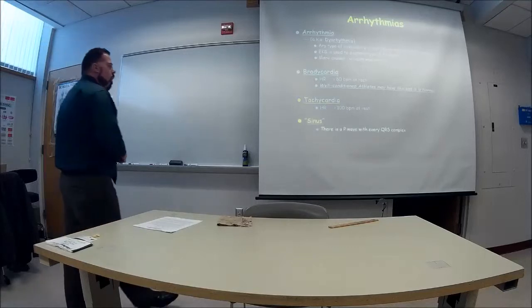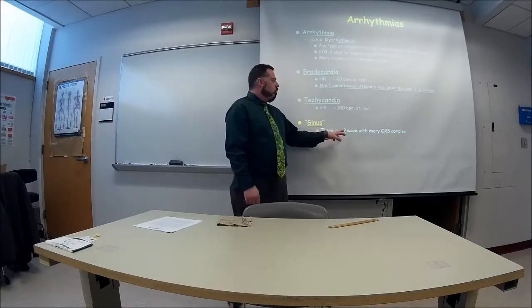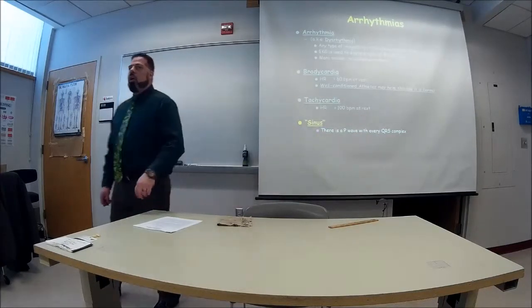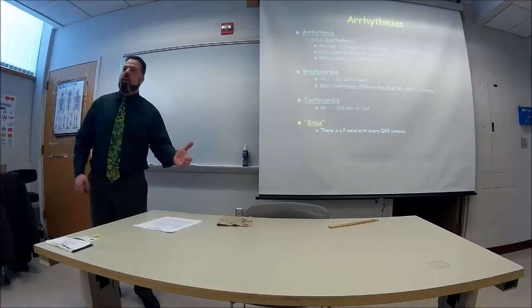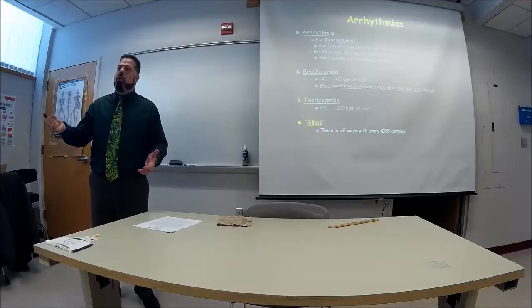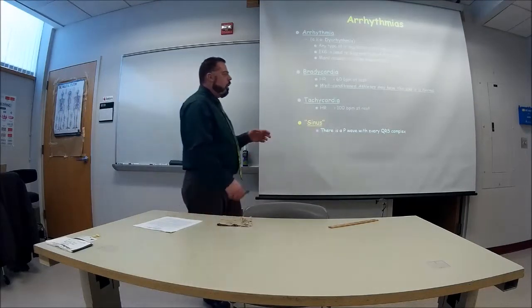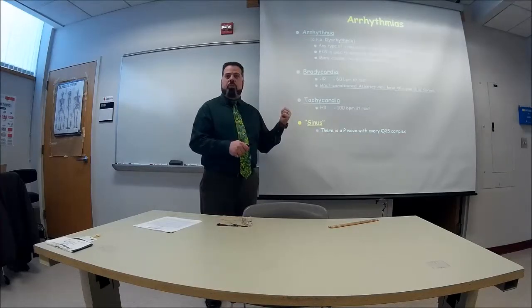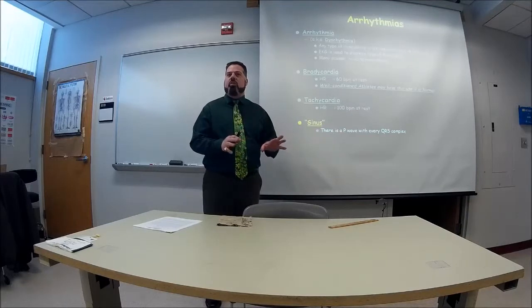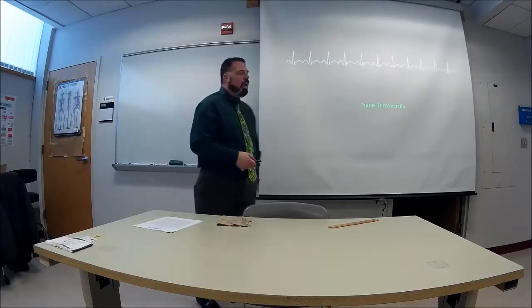Now the word sinus means that for every P wave, there's a QRS. For every QRS complex, there's a P wave. For every atria that's contracting, we should have the ventricles contract. So if you see a P wave with every QRS, like the one I showed you just before, we say it's sinus. So this is showing an example of what we call sinus tachycardia.